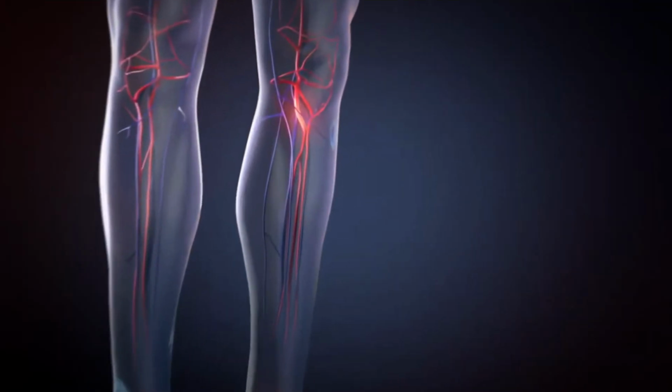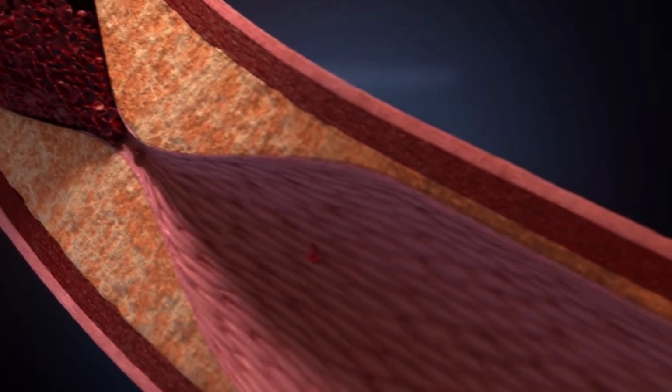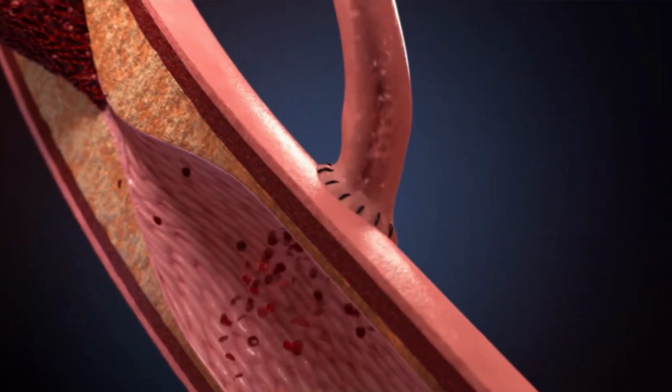This is still being prepared for trial and may need a few more years before it applies to the general population. But once it is available, it will definitely change the dynamics and revolutionize cardiovascular treatment. It can apply to arteries that are less than 5 mm in diameter. No need to extract a vein from the leg for the bypass. It can replace the arteries or the aorta, instead of the Dacron aortic graft.